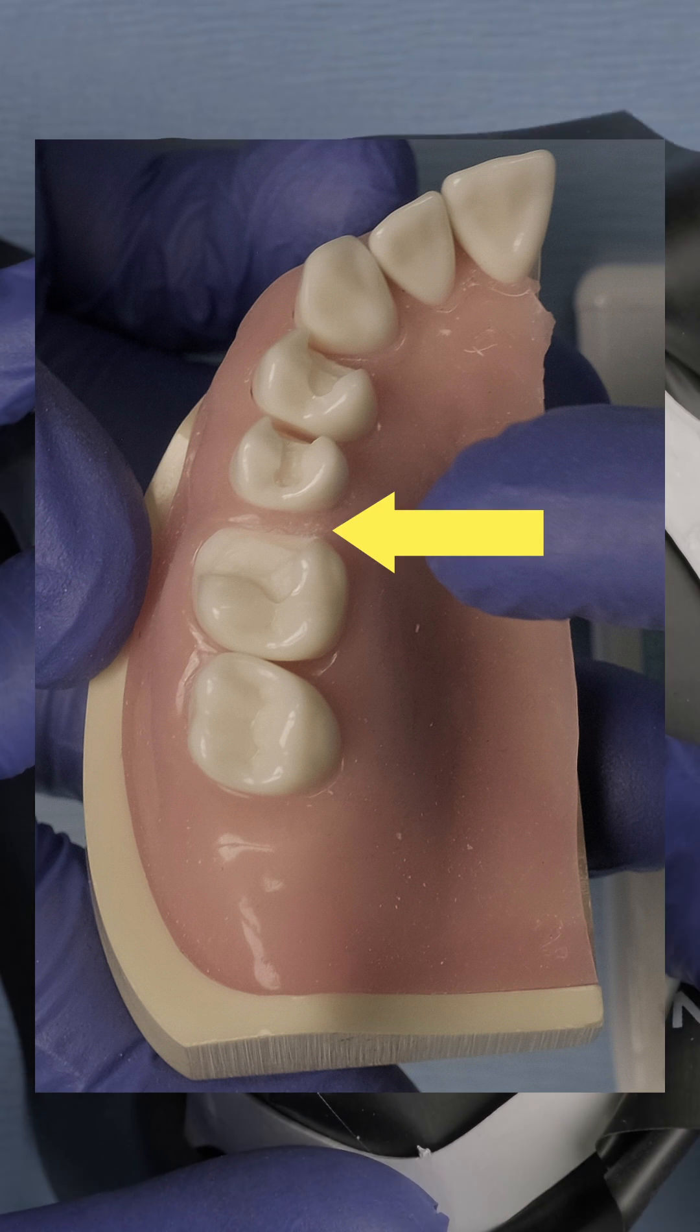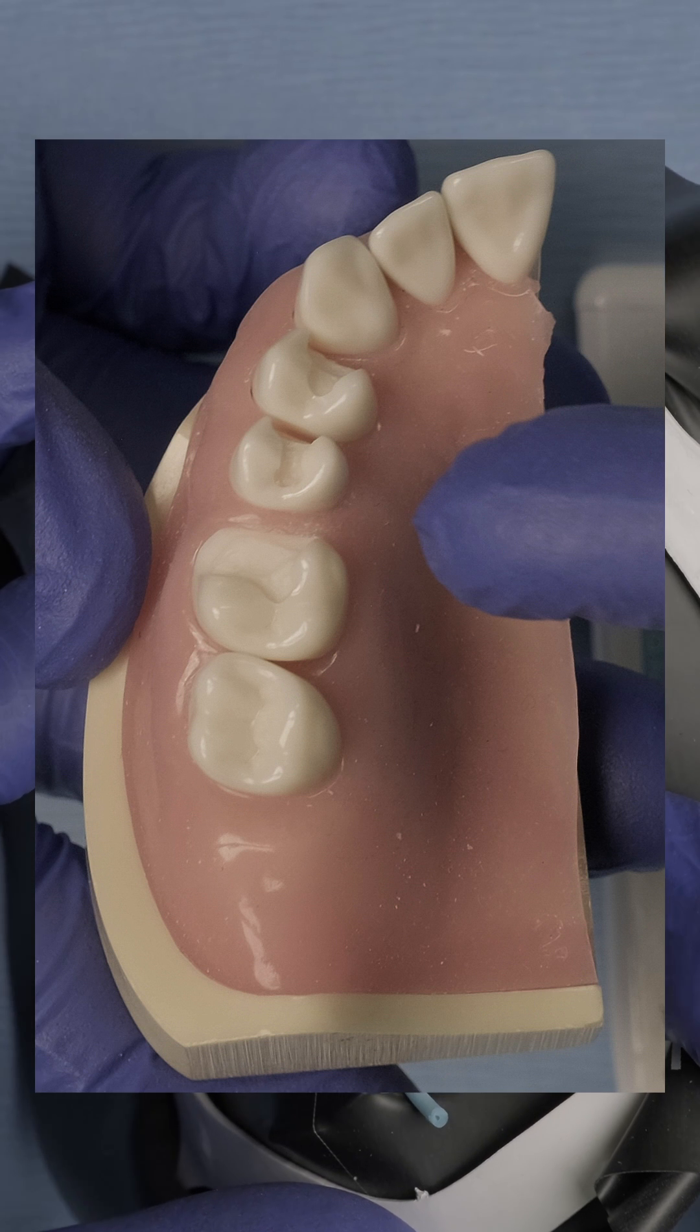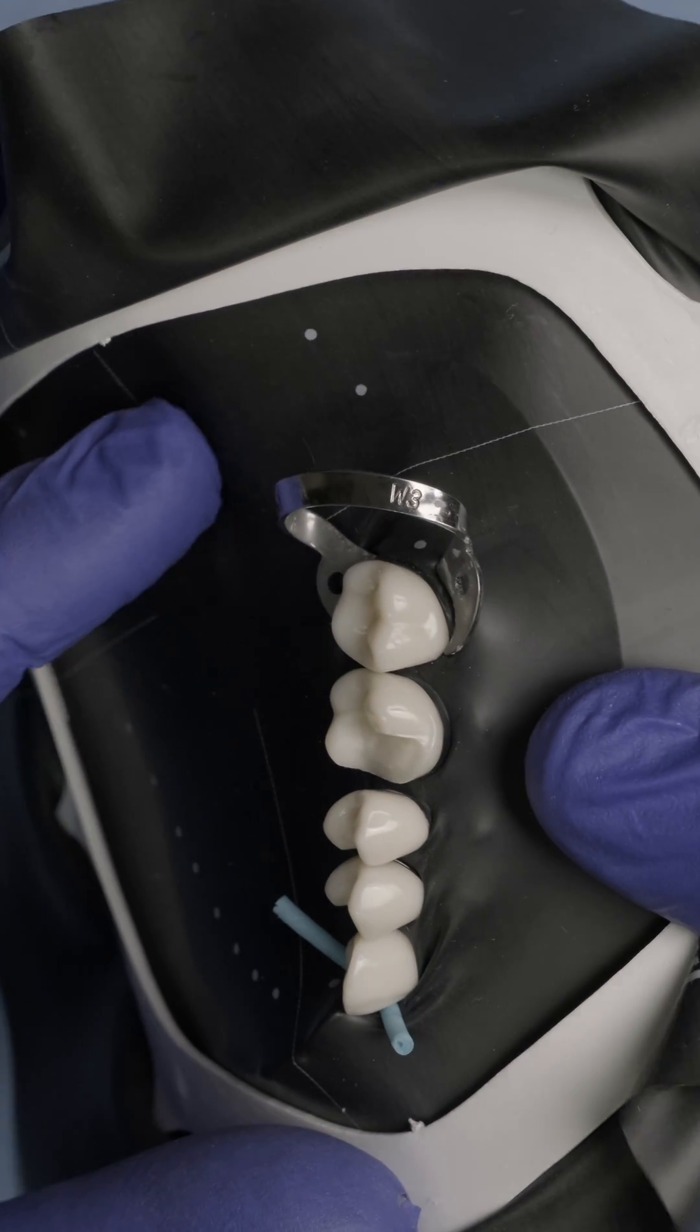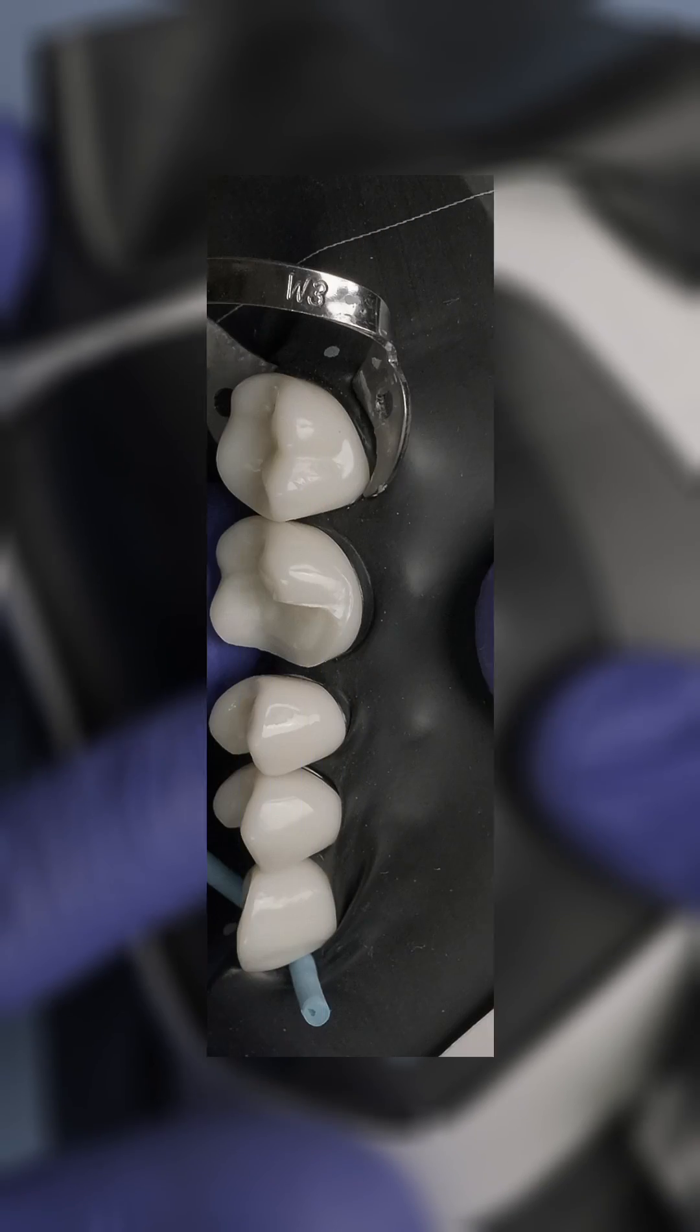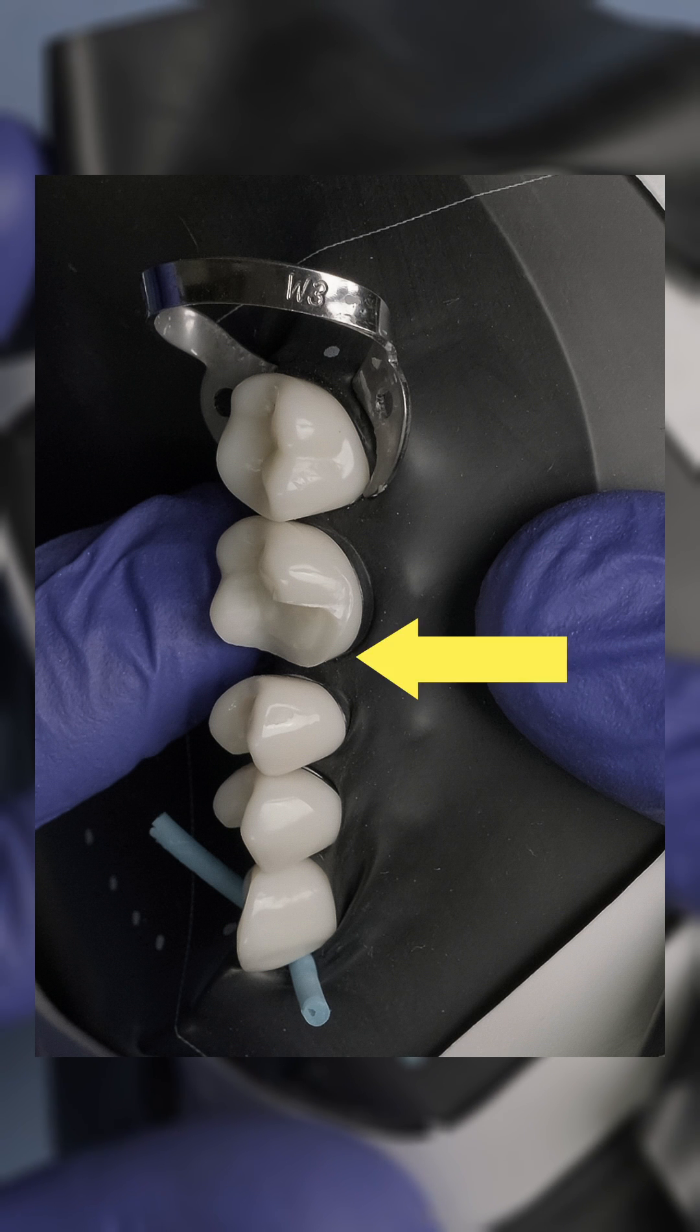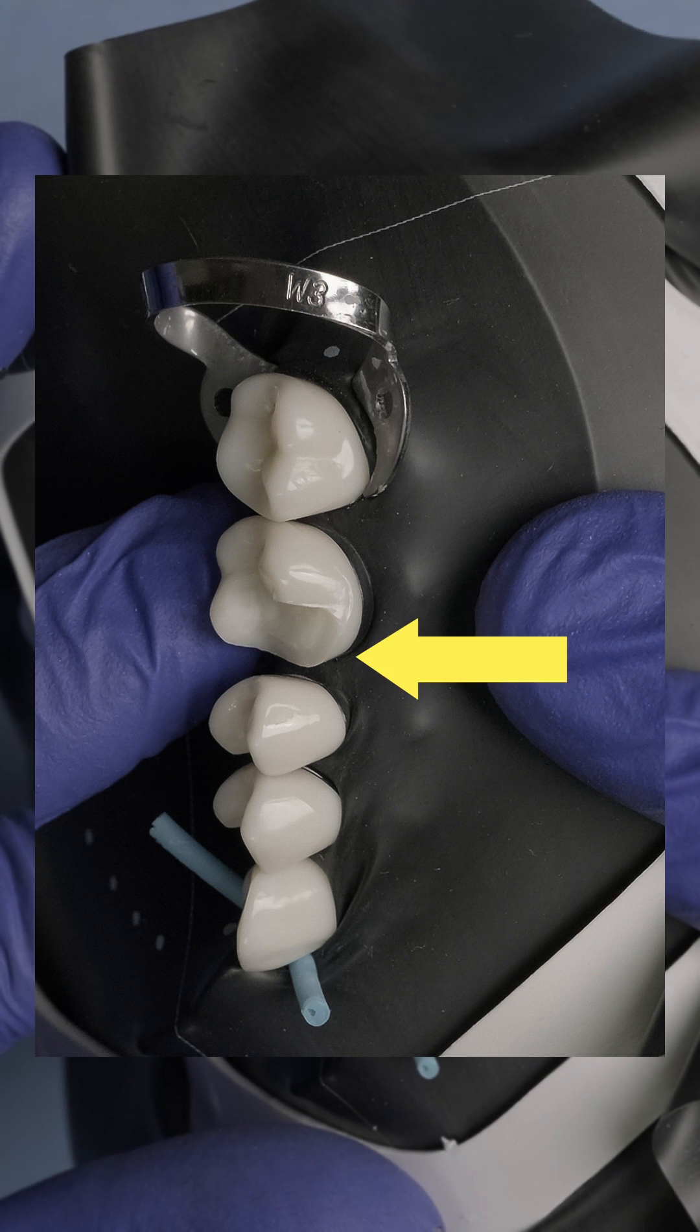Now here, I don't need to use any additional clamps because as you can see, the gingival margin is completely exposed. Now you have beautiful access to that gingival margin, beautiful clean access to the gingival margin.